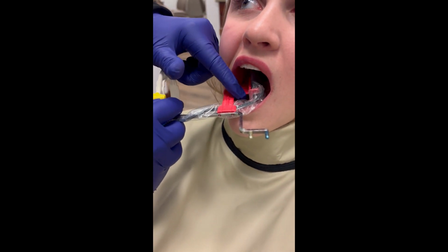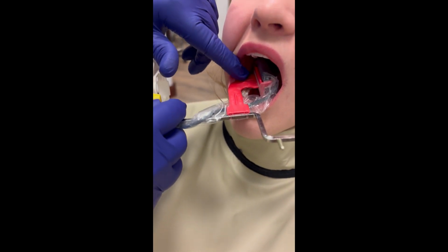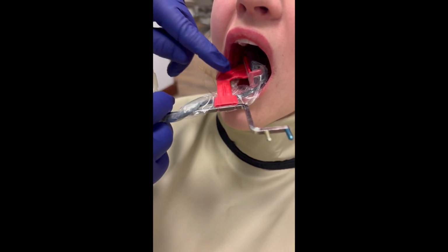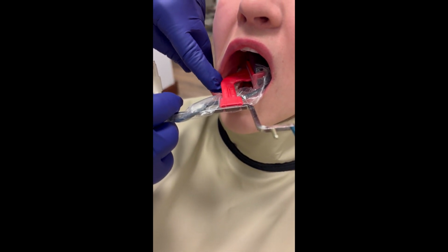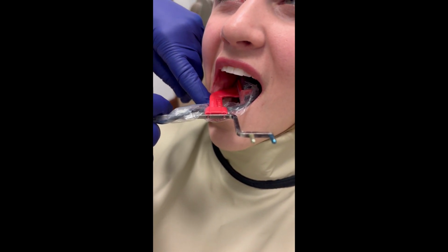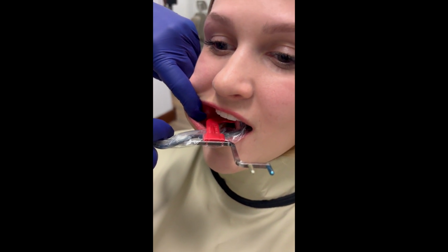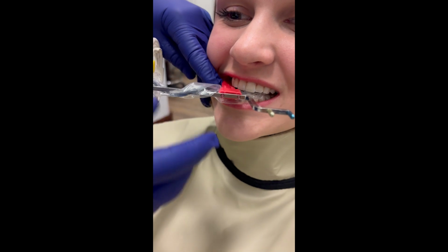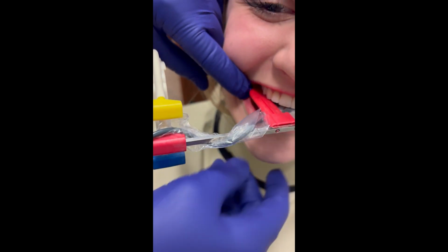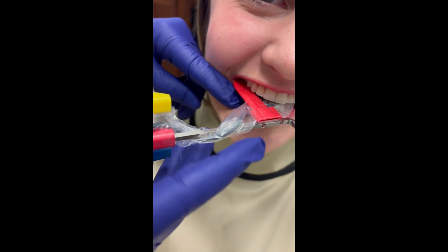I'm trying to capture the distal of the canine in this image. So I'm going to try to angle the x-ray quite a bit over to where even the front of the sensor might be touching the canine on the other side. That way I can access and see the distal of that canine. And then I'm going to tell the patient to go ahead and bite down on that bite tab. Sometimes I'll just tell them to smile, like she's doing, so that I can really see if my sensor is capturing the distal of the canine.